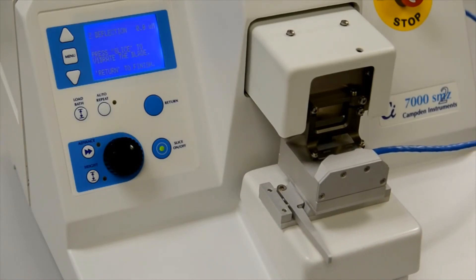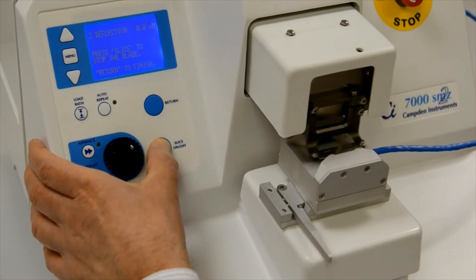The current blade alignment error will now be displayed so press the Slice On-Off key again to stop the vibration.